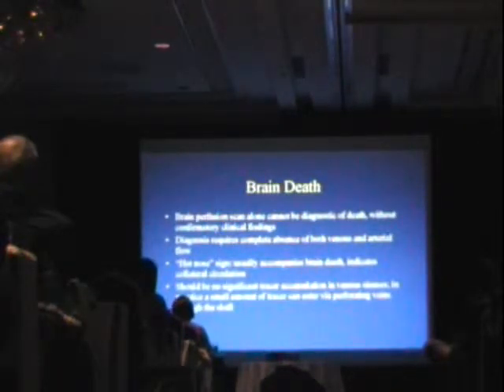Brain death, we'll say a lot about this. It's a fairly simple study. You inject the patient with some kind of agent. Firstly, anything that you have in the laboratory. We use ECD here, but DTPA was the first agent approved for this. And essentially anything in the blood can be used in an emergency to do a brain death study.